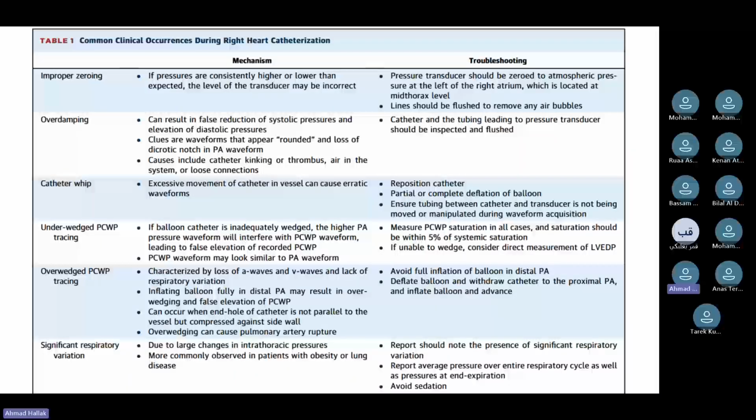especially the people that don't do it frequently, because you look at the interventional attendings at our hospital, for example, they're very good at doing left heart cath. They're good at doing structural cases. They don't do the right heart caths very commonly. They only do them when the advanced heart failure specialists are too busy to do them. And you'll find that people will have erroneous measurements.